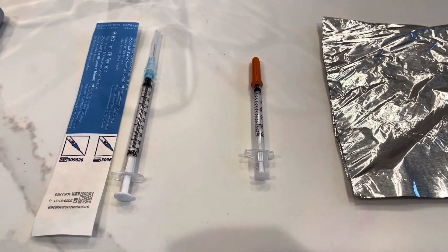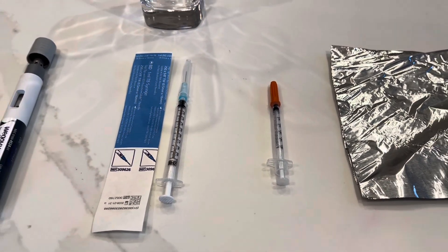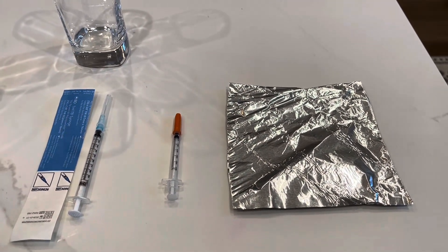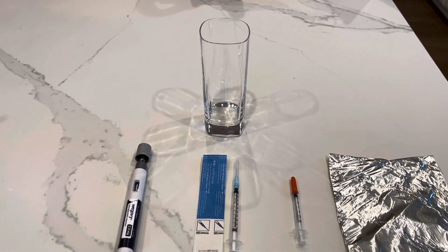And then we need an insulin syringe. This is a 0.3 milliliter one and would be good for this exercise. Finally, a piece of aluminum foil so we can wrap the TB syringe before we put it in the fridge when we're all done, and a tall glass so that if we need to sit something up vertically, we just have a fixture to do that.